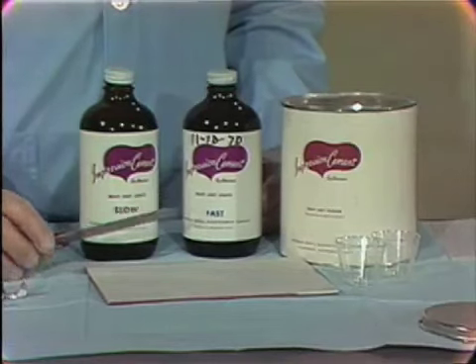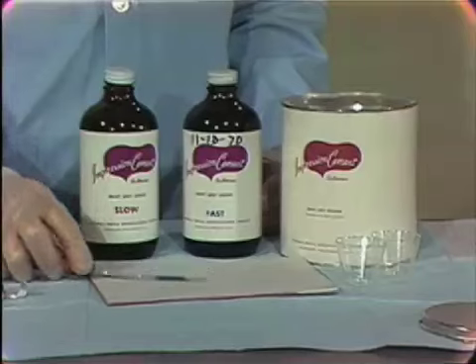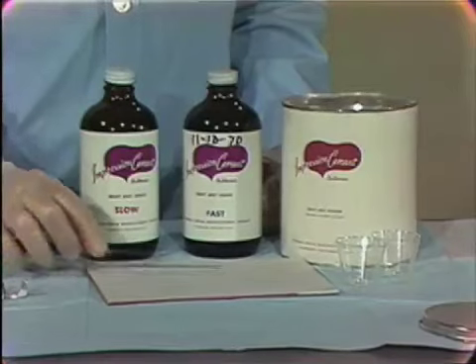So the first part of the mixing procedure is a pressing or a smashing of the powder into the liquid. To get an adequate mix, the manufacturer recommends a 2-to-1 ratio, 2 powder to 1 liquid. You can use measuring cups such as I have here to estimate the 2-to-1 measurement. When you're starting out, this might be a good idea.